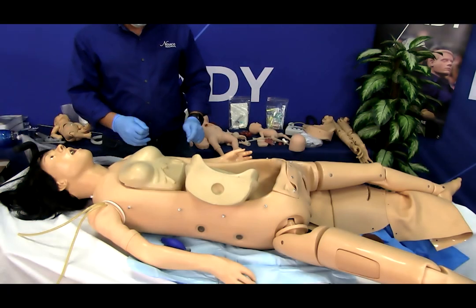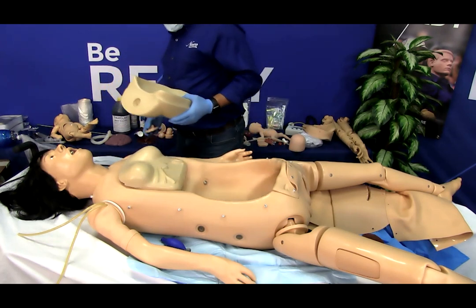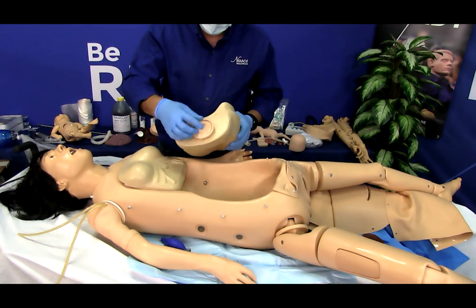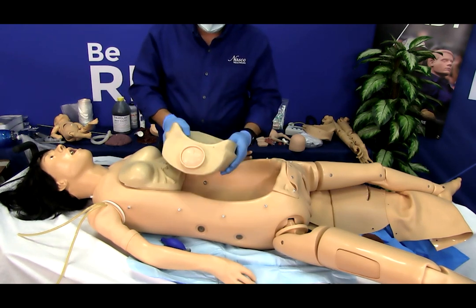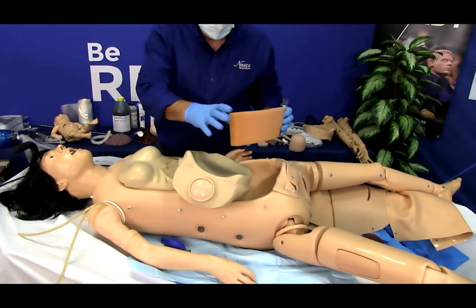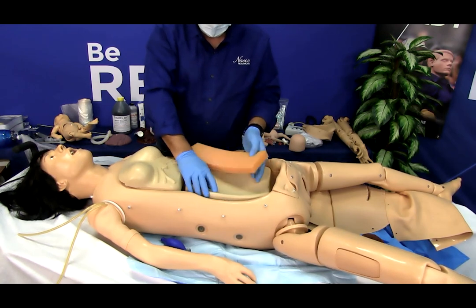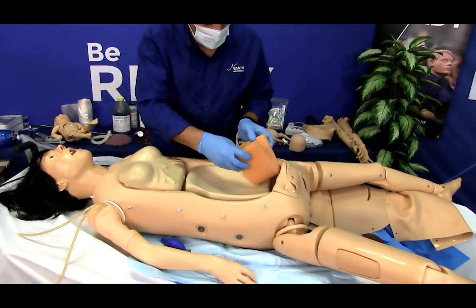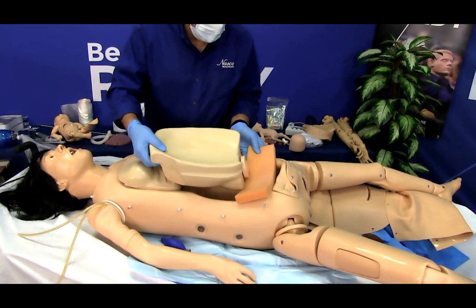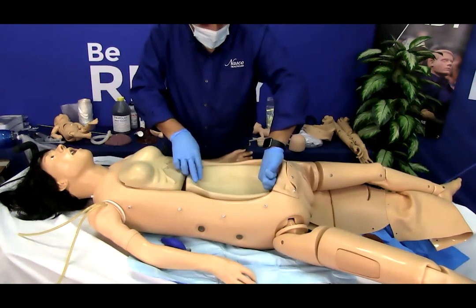To set up cervical dilation and effacement, select the desired cervix module and plug it into the receptacle in the pelvic block. Place the pelvic block in the torso. Position the genital foam stabilizer pad in a U shape between the block and the skin. This will prevent excessive movement of the skin during examination.